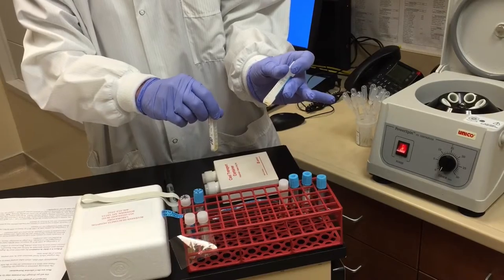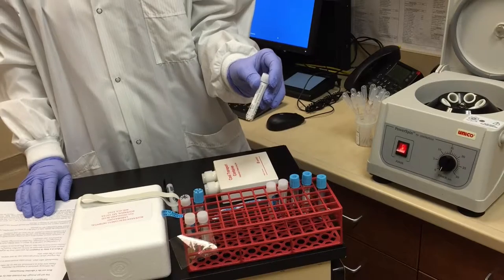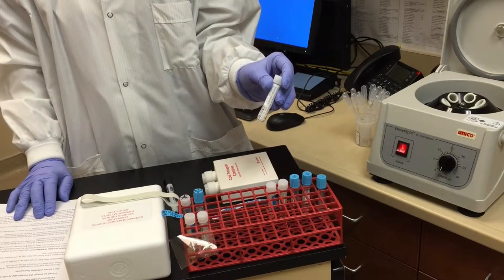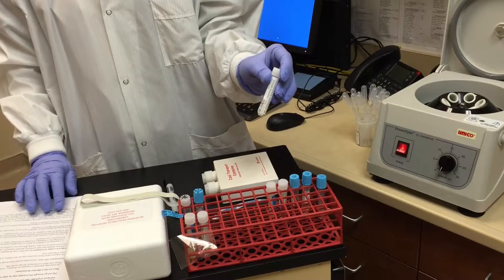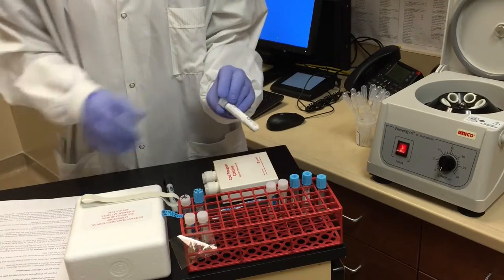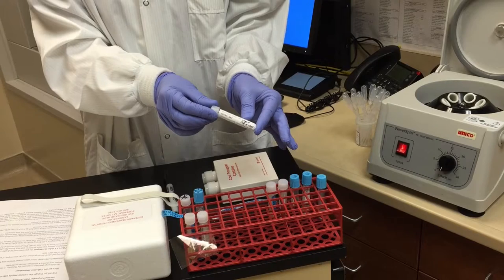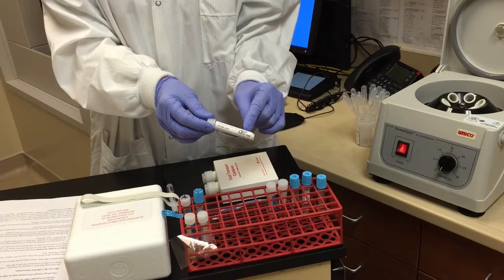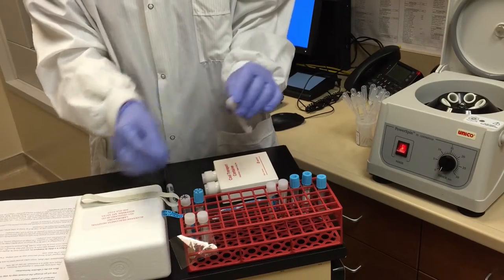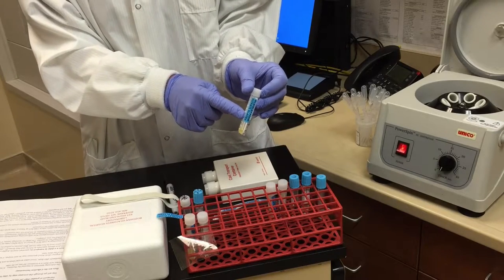Discard the remaining bottom portion. The double centrifuged plasma should be aliquoted into half a ml or 1 ml aliquots into clearly labeled tubes. The tube should be labeled with the patient's name and date of birth, the date and time the specimen is drawn, and the collector's initials.